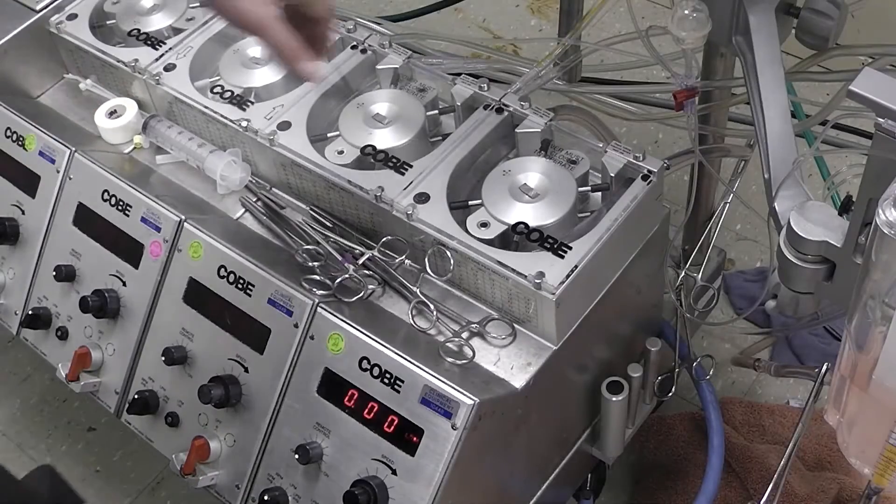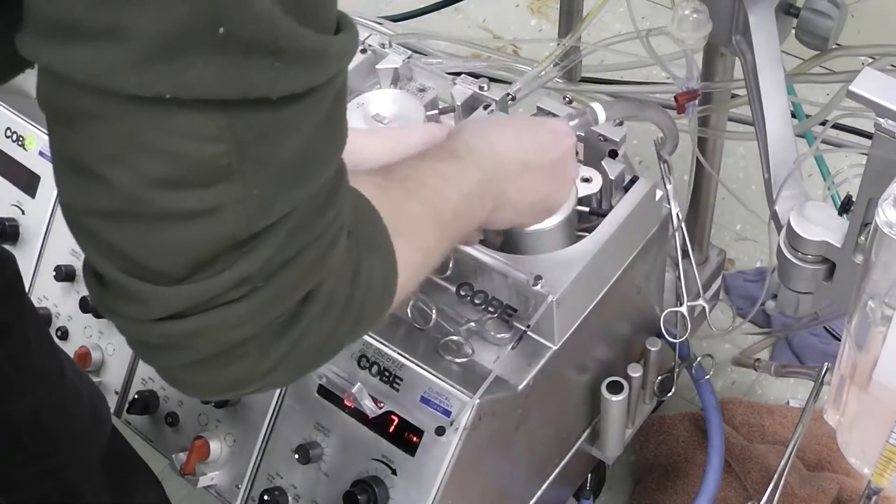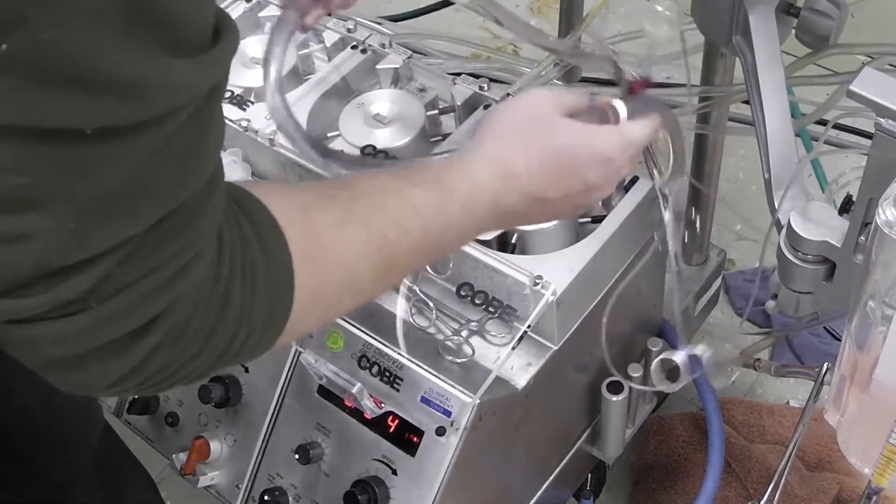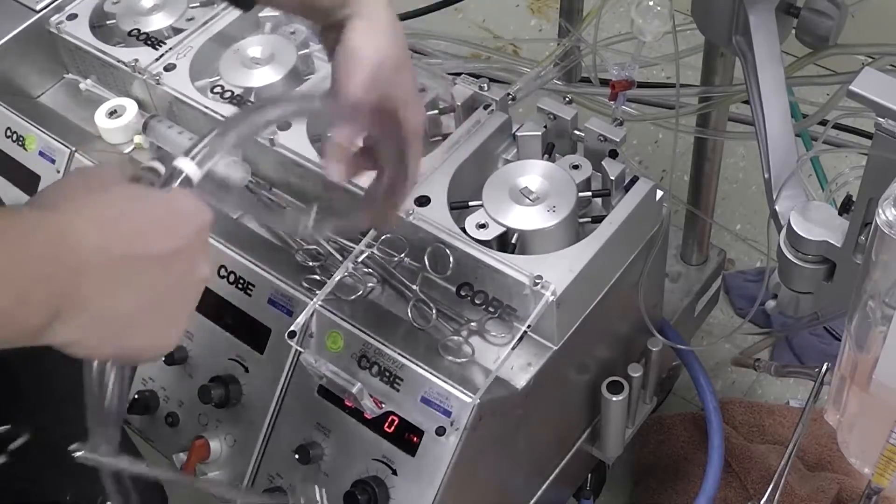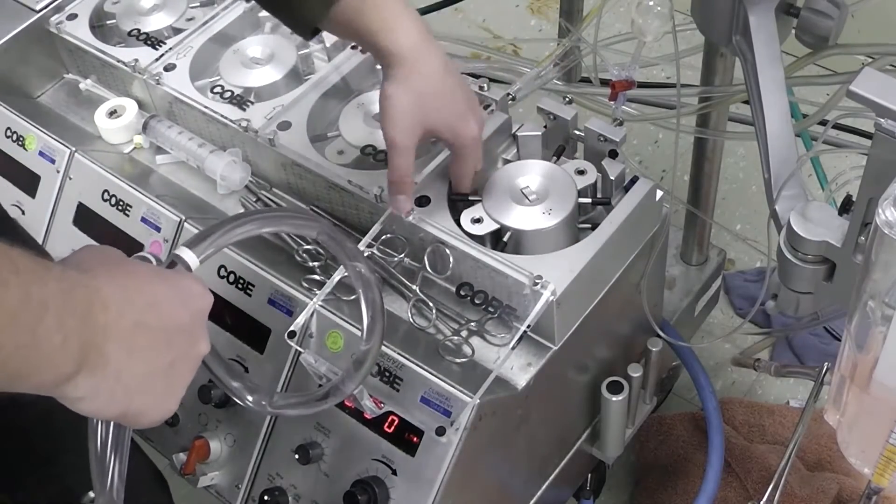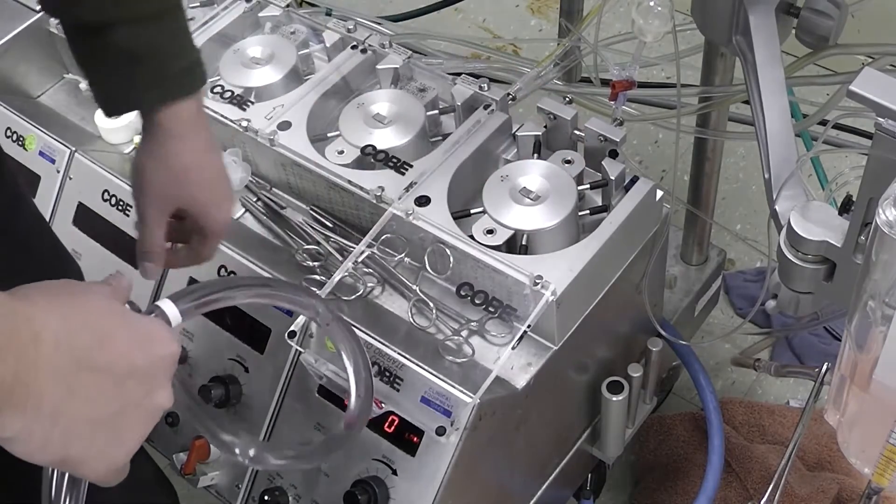Next we're going to remove the arterial line from the pump head and we're going to save this tubing so that we can inspect what went wrong with it. We're also going to look in the raceway here and see if there's any debris or anything sharp or anything in there that may have caused the pump head failure in the first place.